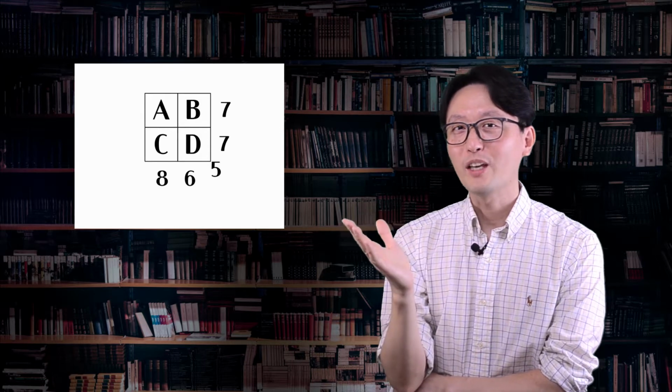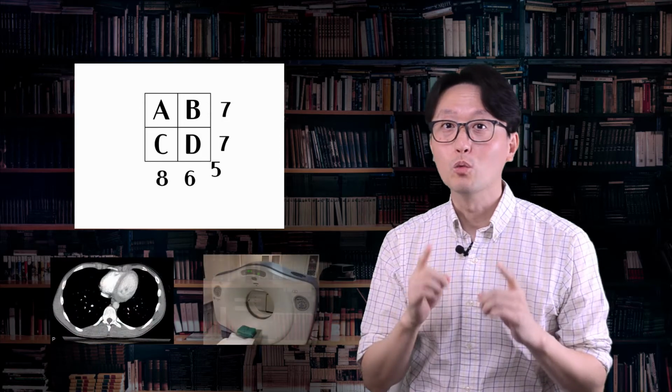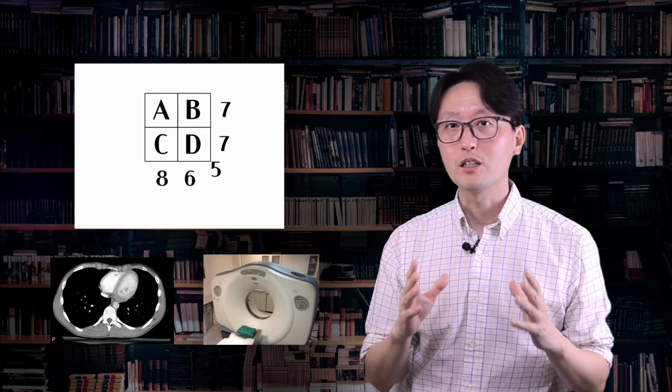Well, why do we have to do this? If you understand this simple mathematical problem, you will be able to understand how computed tomography works.